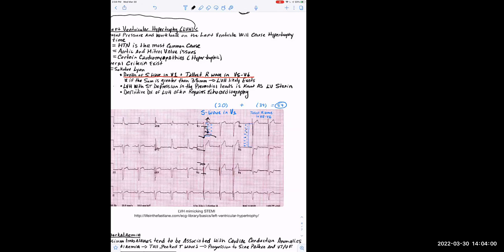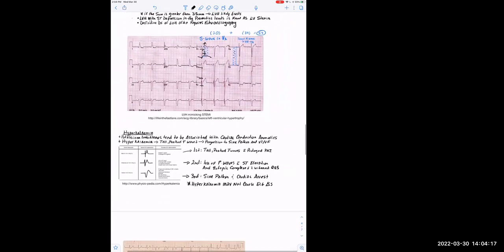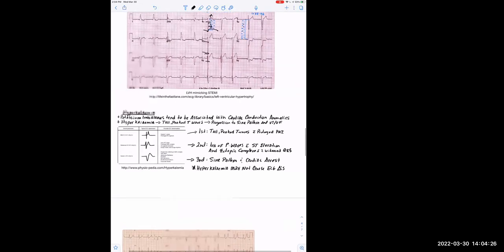So, all right, Chris, anything you want to clean up there? No, that's fantastic. And this is a fairly common finding. And you can see, again, like a lot of these things, it's fairly nuanced when it comes to diagnosing it. We just want you to be thinking more broadly, like, hey, does the history and physical exam match what I'm seeing on the 12 lead? And if it doesn't, you need to start thinking about different kinds of mimics.